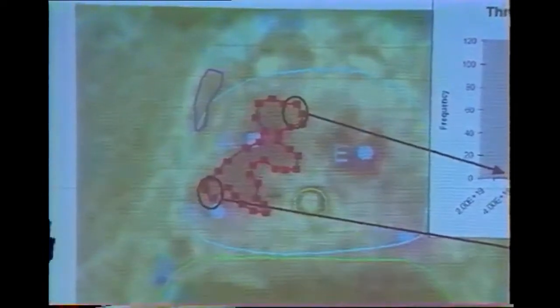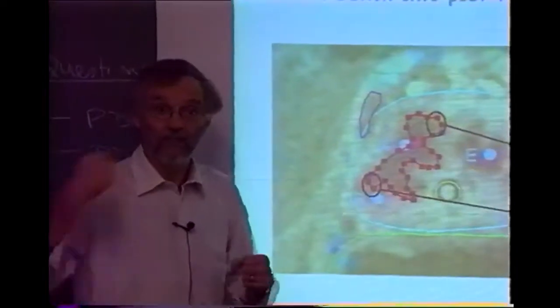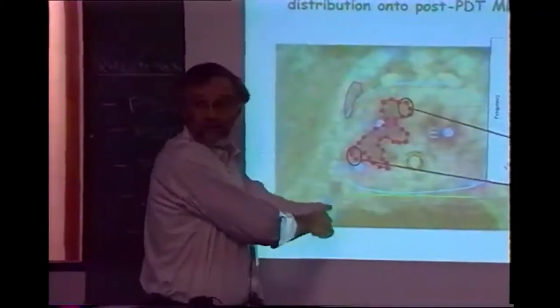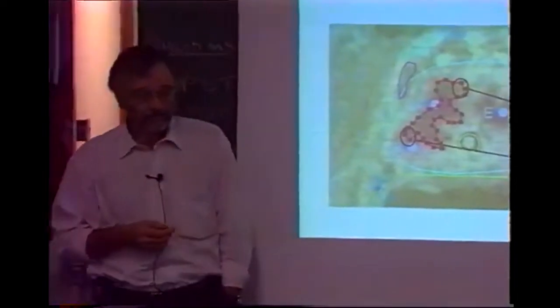And now it becomes a challenge. It's probably going to be impossible to measure all these factors. So what do we do to make this treatment more successful? Do you just keep increasing the amount of drug, increasing the amount of light? You're concerned here because the rectum is here, so you can't just keep increasing indefinitely.